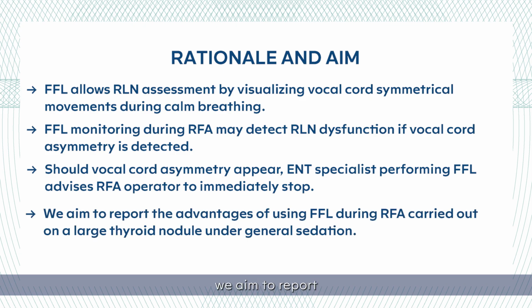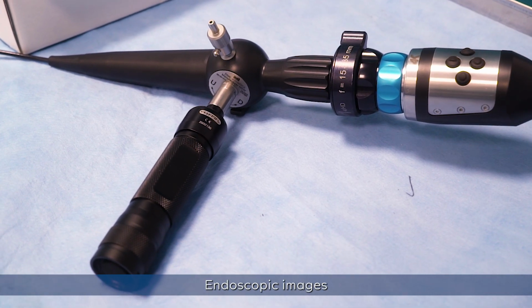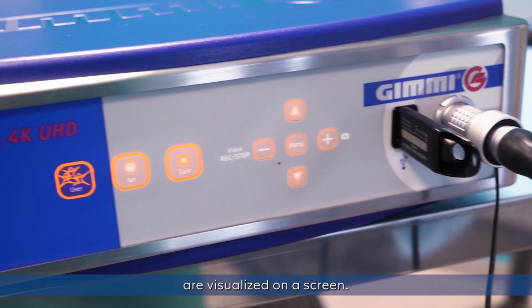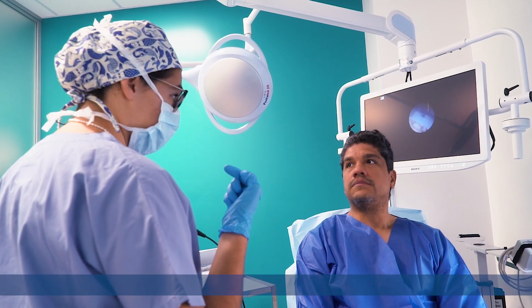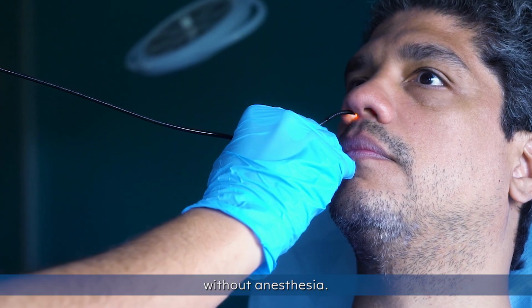In this video, we aim to report the advantages of using FFL during RFA carried out on a large thyroid nodule under general sedation. In the preoperative phase, the fibroscope is connected to a camera. Endoscopic images are visualized on a screen. This exam is performed in an ambulatory setting without anesthesia.